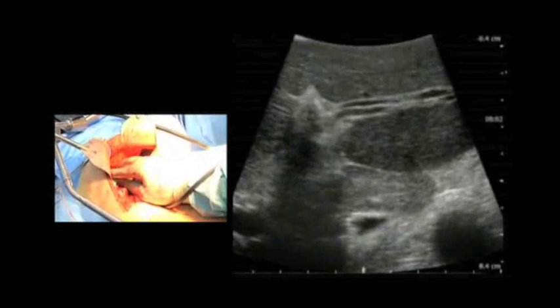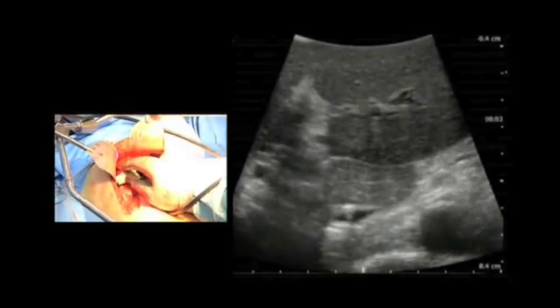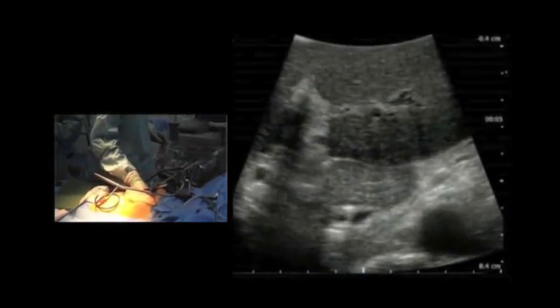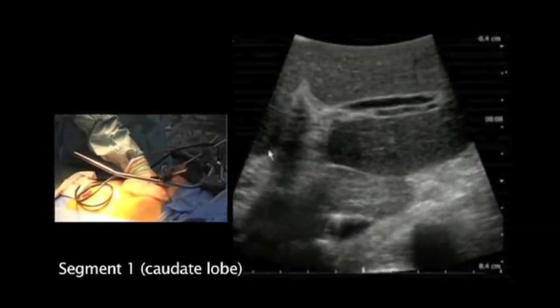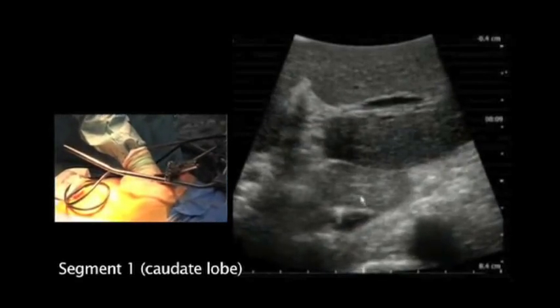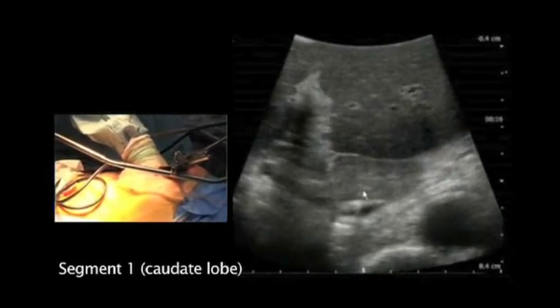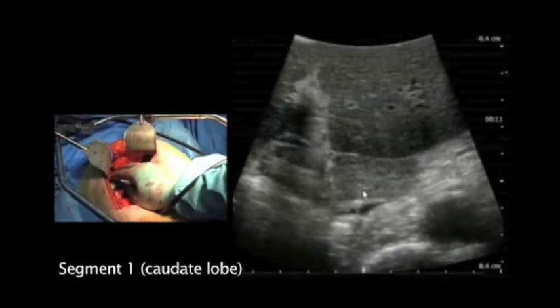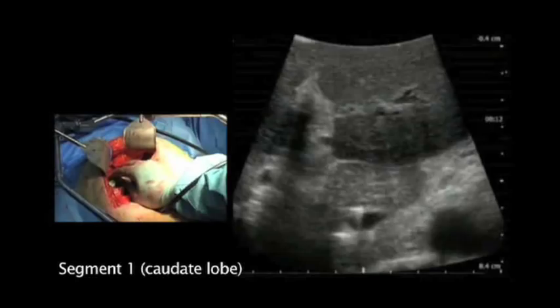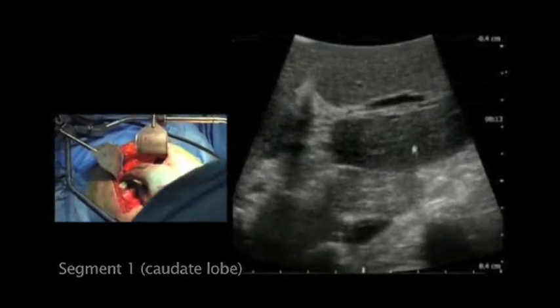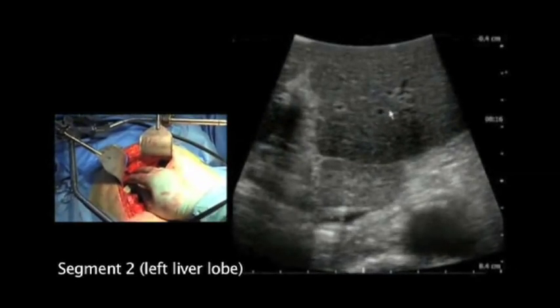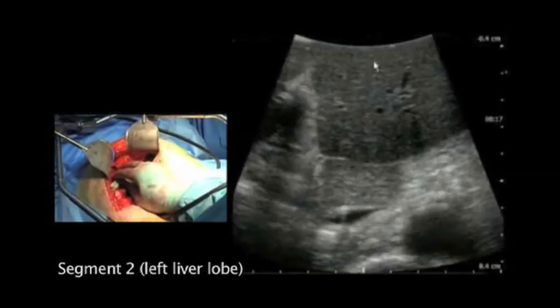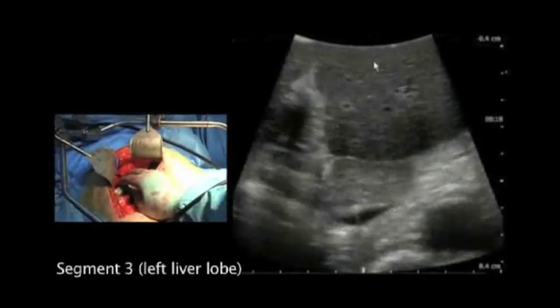The first thing I'm doing is identifying the central part of the liver. On the screen we can see segment number one in the middle of the picture. Above it we have segment number two, and above the portal structures we have segment number three.